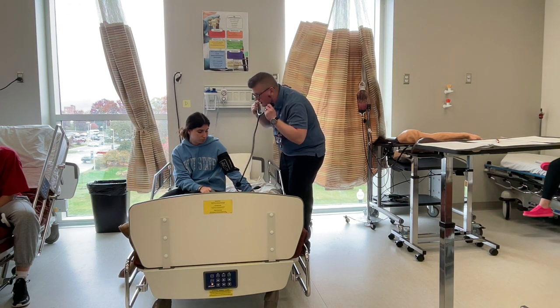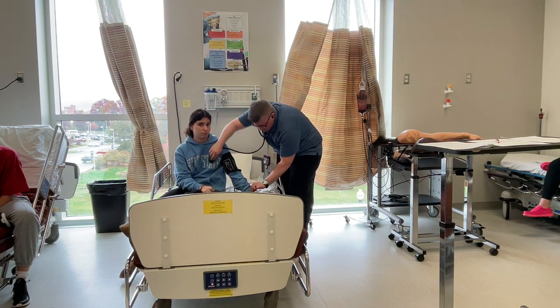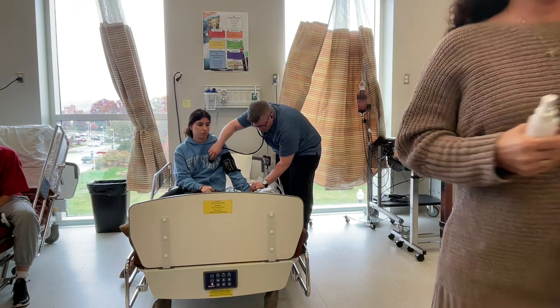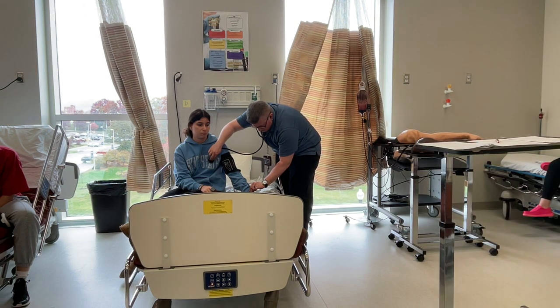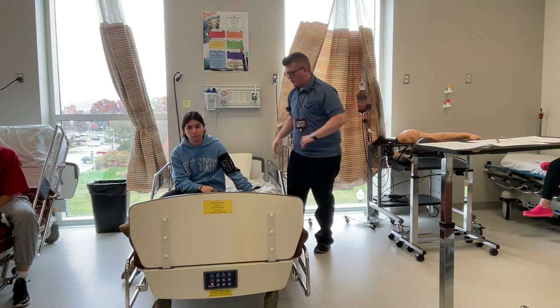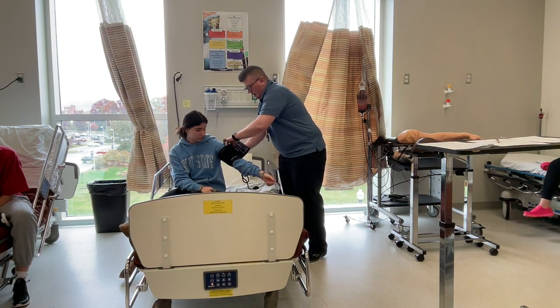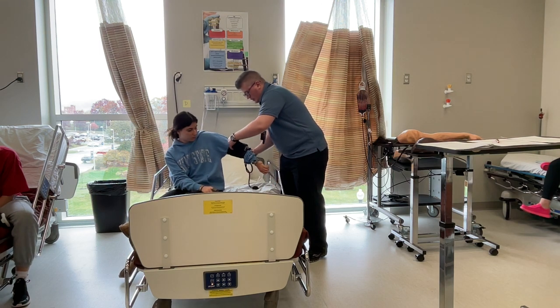Also at this time, I'm just going to listen to your apical pulse just to confirm. And I would listen for 30 seconds to make sure that the radial pulse is correlating with the apical pulse and it's correlating with the pulse oximetry, which it is.